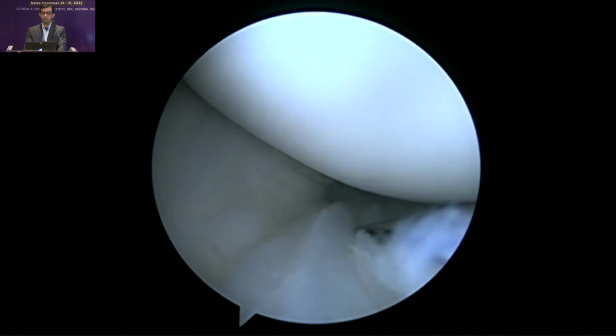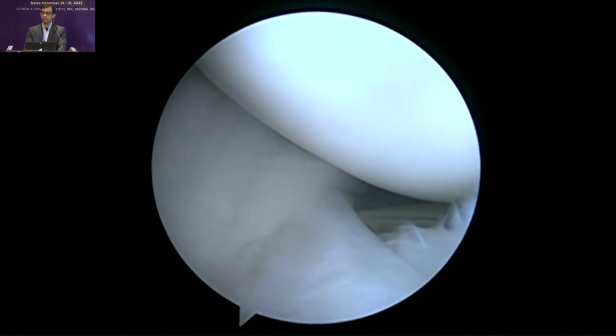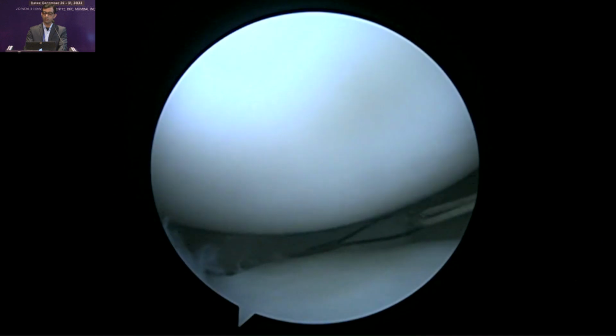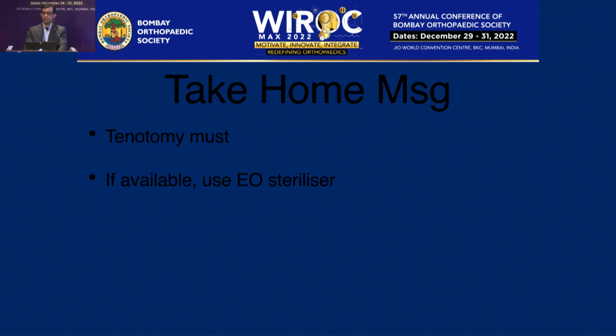Similarly, this we have already seen. This is also a standard needle which you can use for the meniscus repair from the inside-out technique. This is also a disposable one, but you can use it as per your want for another 2-3 cases to make it affordable.